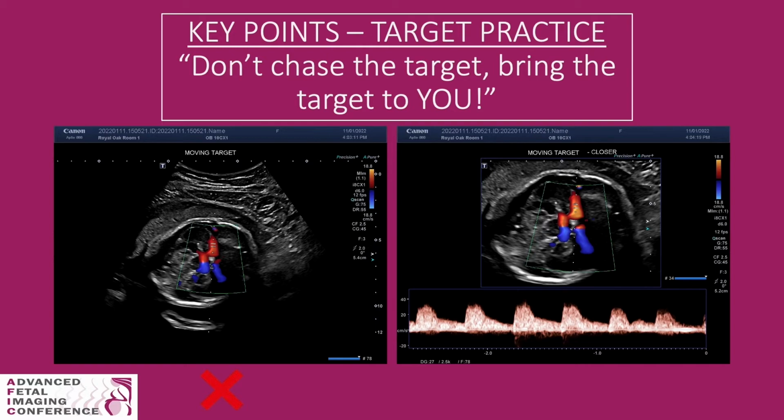It is important to note that sometimes a baby will only give you one opportunity to obtain that critical sample that can change the management of the pregnancy. So when the opportunity arises, we all need to make sure that we are ready.